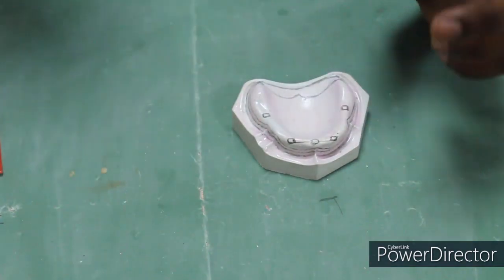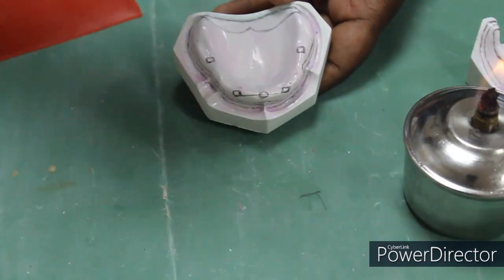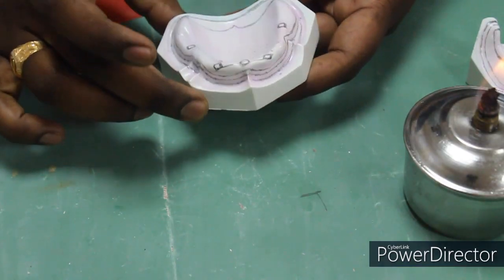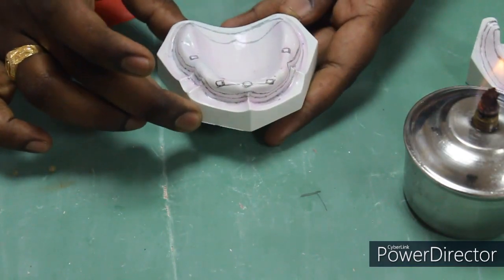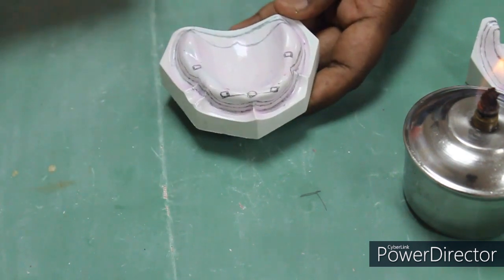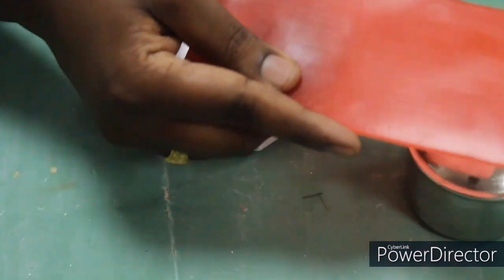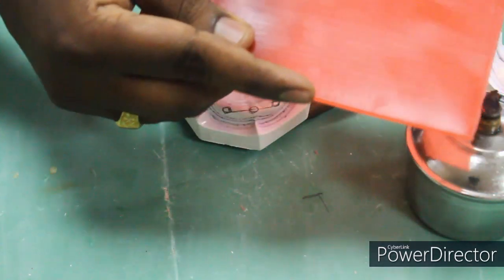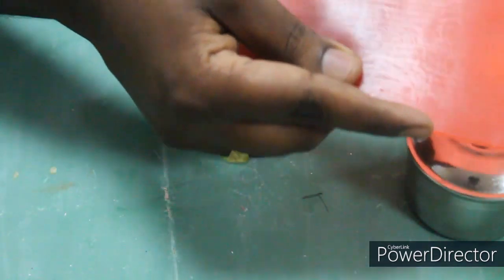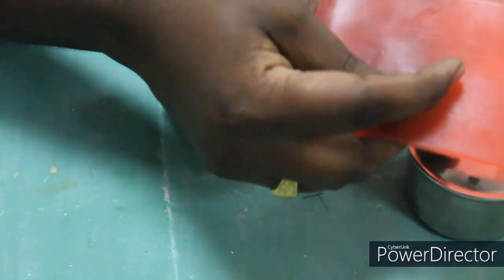Similarly, we have to apply it for the mandible also. Now the cold mold seal applied has dried. So now we are going to adapt the wax sheet onto the cast. You have to take a sheet of base plate wax and heat it gently. You should not melt it, only soften the wax.